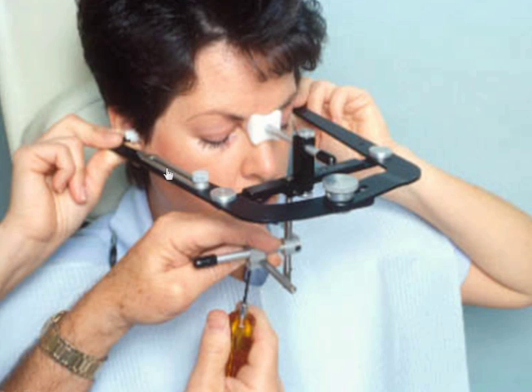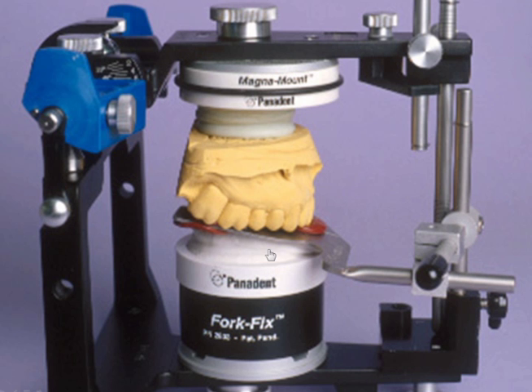The upper surface of the Facebow is your plane of reference, capturing the axis of the patient by using the ears, referencing 22 millimeters below nasion, where the average border of the eye is, referencing the upper frame to orbitale. The bite fork is capturing the plane of occlusion, and then the clamps here are connecting the two planes together. And then we can transfer that information to the articulator that also has an axis orbital plane of reference in relationship to the patient's plane of occlusion.